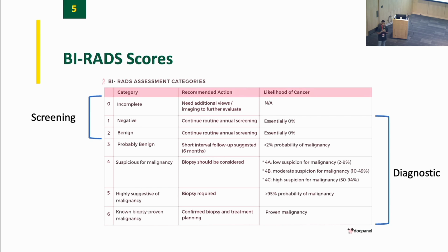Okay, or if they find that it's nothing, if they look at the screening exam and they say that I don't see anything concerning, they'll assign it a BI-RADS 1, meaning negative, means I saw nothing, or BI-RADS 2, which is benign, meaning I saw something, but I know the thing that I saw is benign. So for example, I see an old scar from a previous resection that hasn't changed for the last 2 years. I know it's benign. So I didn't see nothing, but I saw something that I'll talk about, but I'm not worried about that thing. And those patients that get BI-RADS 1 and 2 come back next year. Patients that get BI-RADS 0, they come back usually within a few weeks to get their diagnostic imaging.